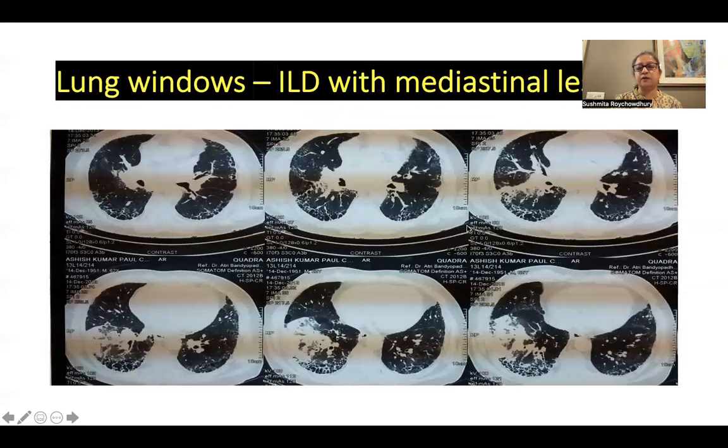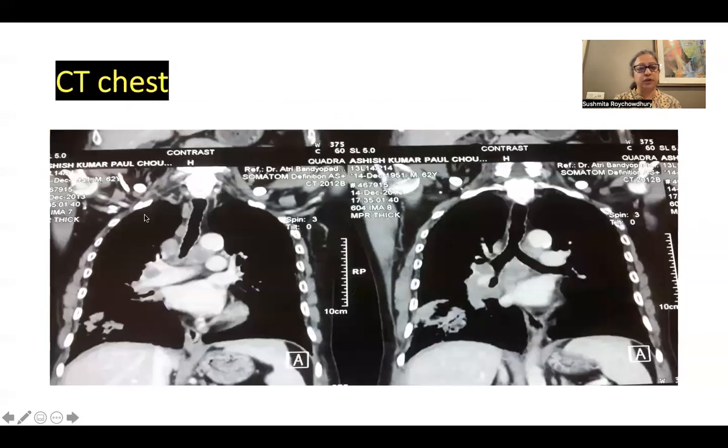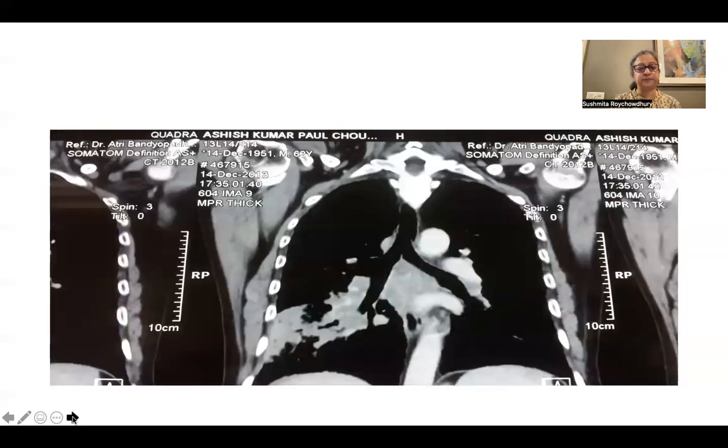Similarly, in patients who are very sick, for diagnosis, some radiologists will tell you we can do a CT guided biopsy of subcarinal nodes. But somebody who has this kind of a lung, would you really want any kind of a pneumothorax? No. So look at this. He has multiple lymph nodes here, and an EBUS is easily done under conscious sedation, not even general anesthesia. And in this gentleman's case, this was a small cell lung cancer. As you can see, there's a lymph nodal mass, and easily by going here, we got a sample and gave him a diagnosis.